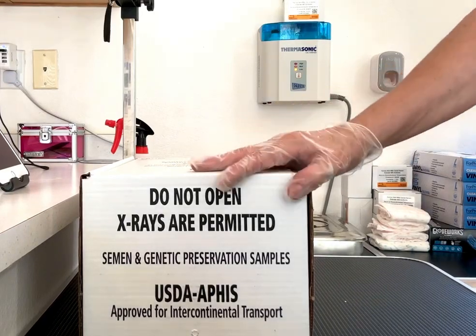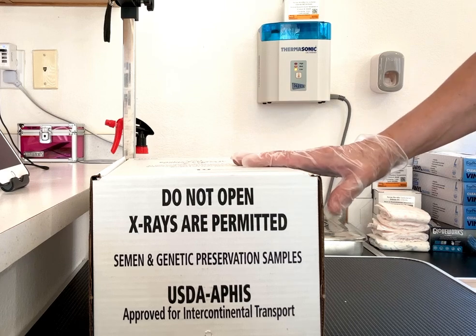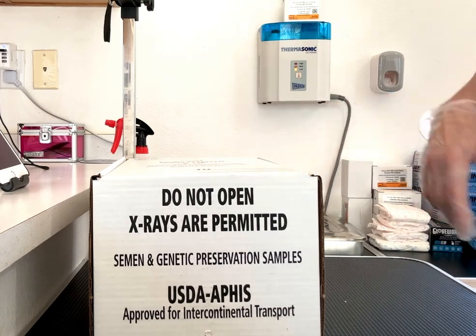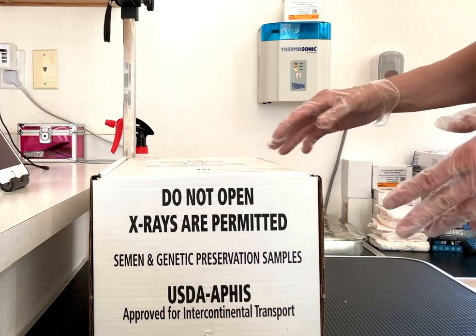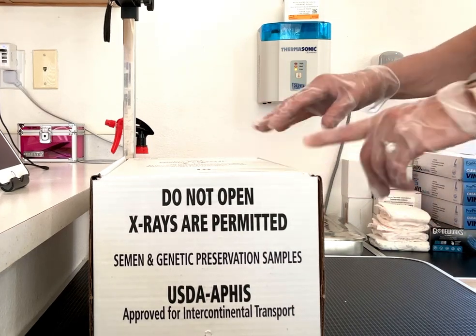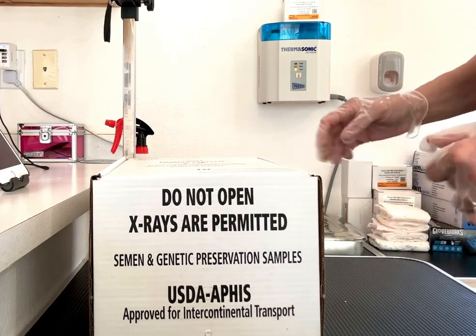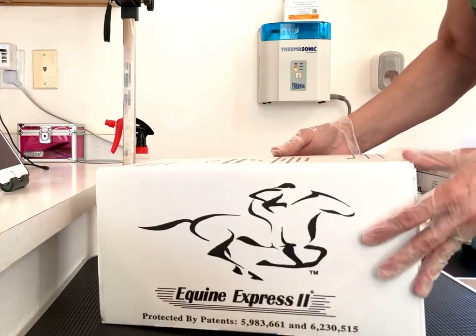Hi, I'm Andrea Kabibi from Taxonix Cream Dachshunds, and this is the first of two videos on how to receive and inseminate your female dog with semen — chilled semen — that's been shipped by us overnight with UPS, and what to do once you receive it.